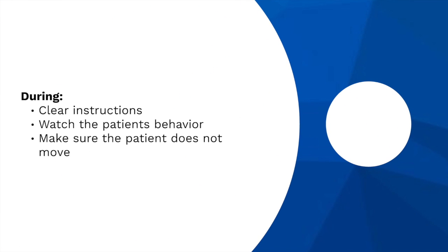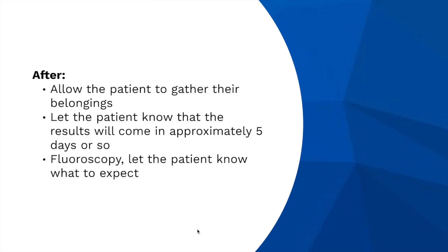During the procedure, you will make sure that the instructions you give are clear for the patient to understand. You will watch their behavior to see if they are in any pain and comfortable, and you will make sure that the patient doesn't move when you take the x-rays. After the procedure is done, you will allow the patient to gather their belongings and or get dressed. You will let them know that the results will come in approximately 5 days, and if the patient was under an exam in fluoroscopy, you will let them know what to expect when they get home or later that day.